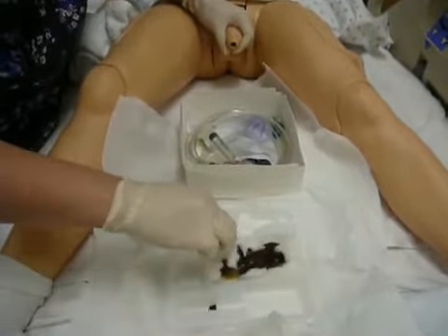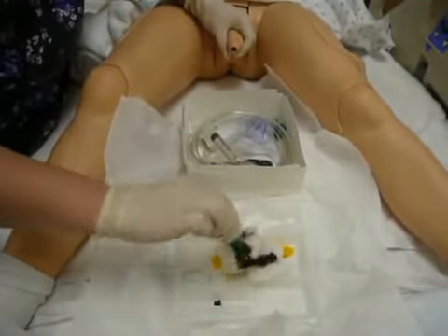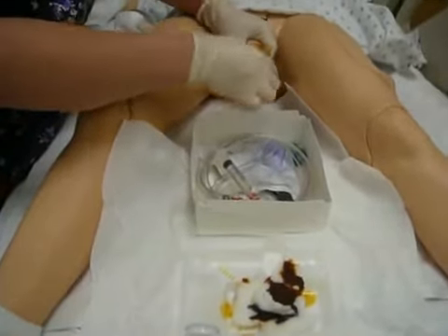I'm going to start with the betadine. It might be helpful if you tell your patient it's going to be a little bit cold because it's room temperature. And so I grab it with my sterile forceps, and I start at the middle and do concentric rings around to cover the whole tip of the glans penis.